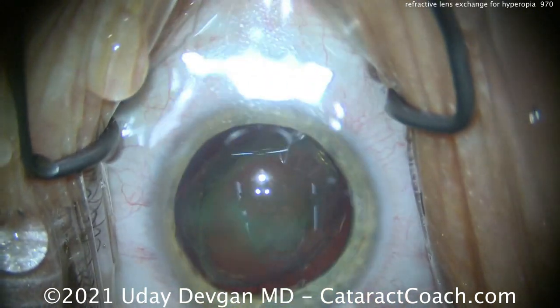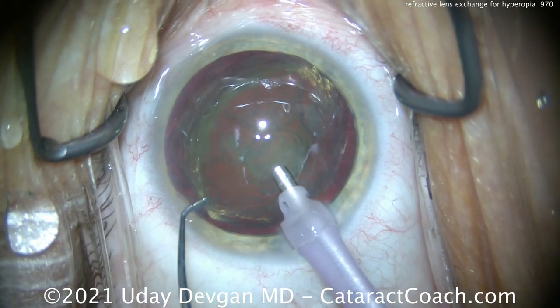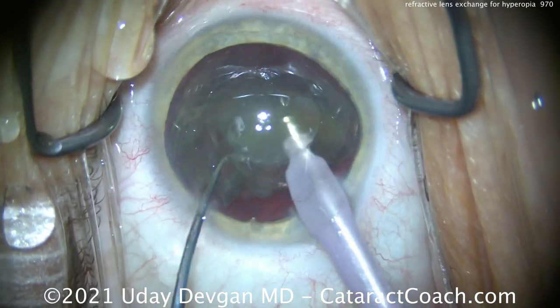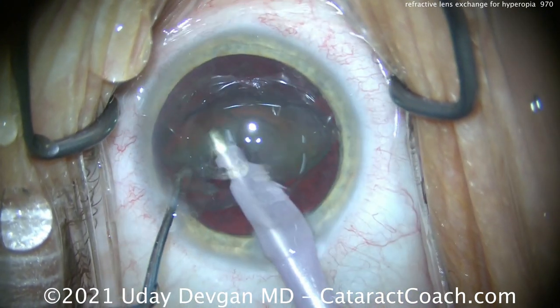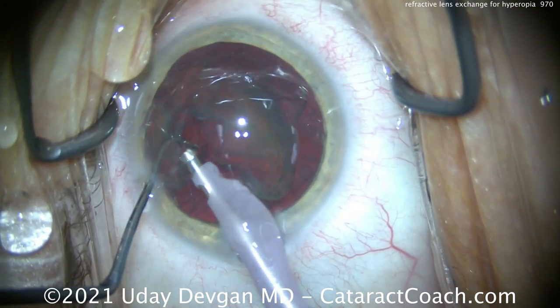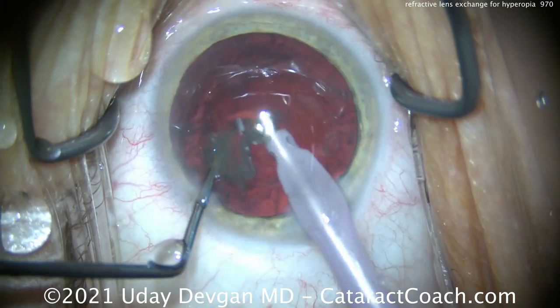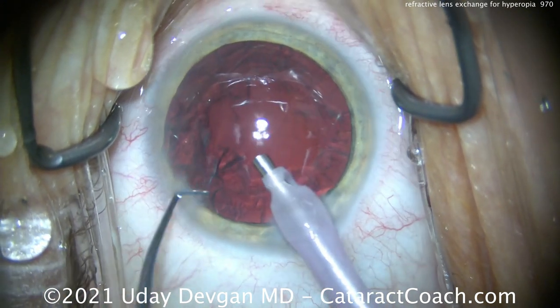If you look at the lens nucleus, there is some opacity in it — it's not perfectly clear, but this is not visually significant. This patient with the highly hyperopic correction was able to achieve sharp distance vision, and with an additional add was able to have near vision. But this patient really wanted freedom from glasses, particularly for doing sports, and didn't tolerate contact lenses well.